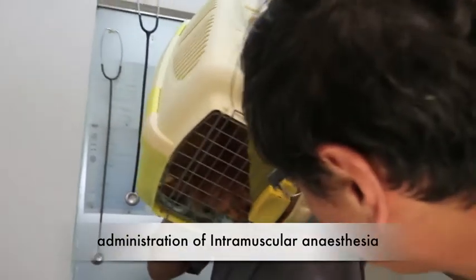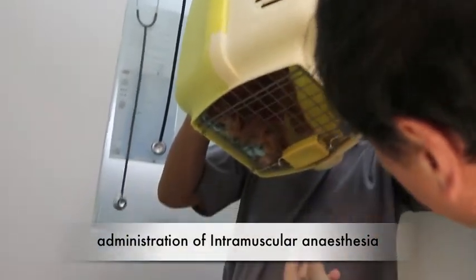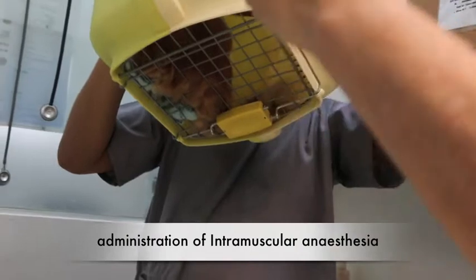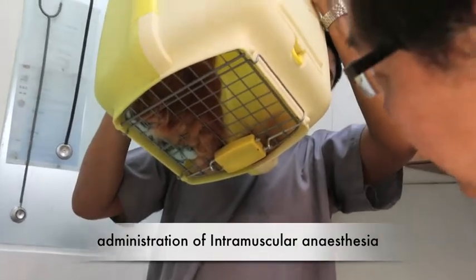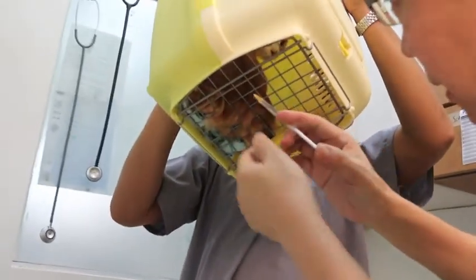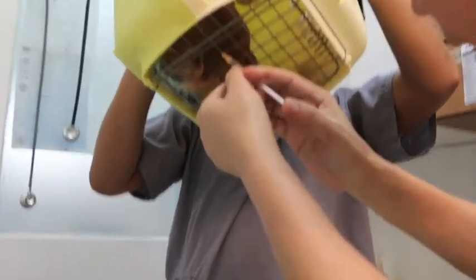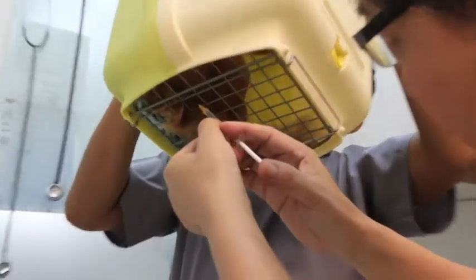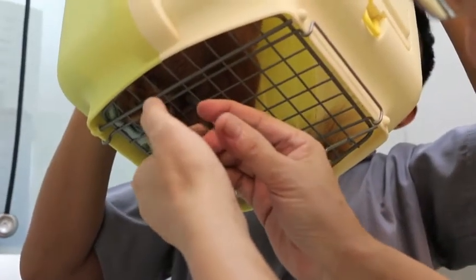Up, up again, vertical up some more, up some more, then tap, tap here, tap the... okay, ready, up some more. Okay, so I will inject here, you see, okay, finish, that is how it will be.